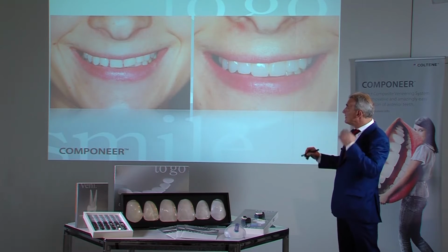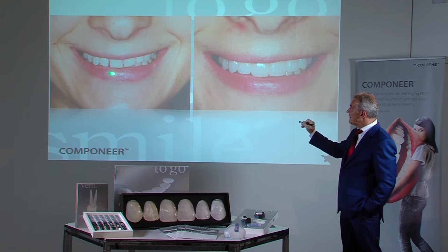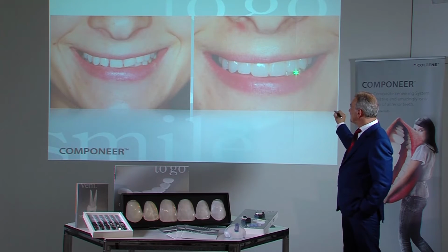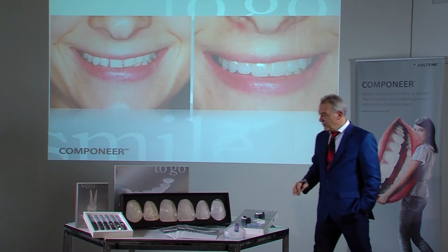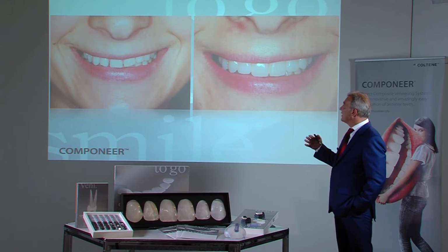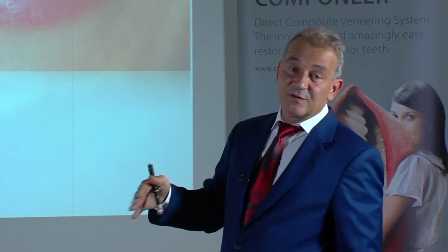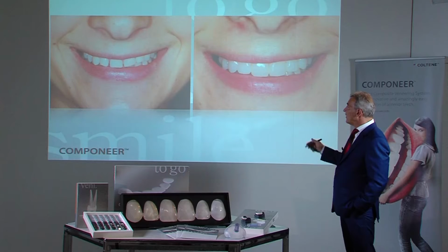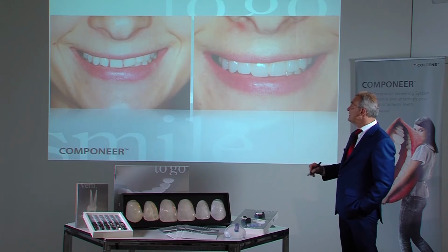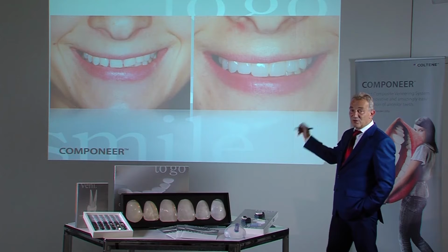Nonetheless, the smile line is completed in the end. One can also see that the central incisors now follow the contour of the lower lip. On the right side, we had to stay a little bit short of the lower lip, as this would not have had a pleasing appearance. In brief, everything has to match: upper lip, contour of the bridge of the nose, bipupillary level, and often the upper and lower lip do not have a congruent shape. Here one can see that the upper lip has a slight deviation to the top left.